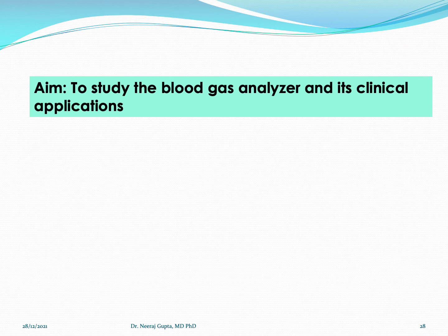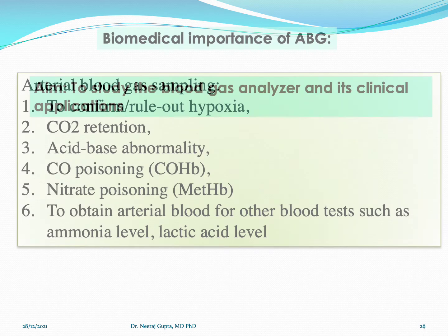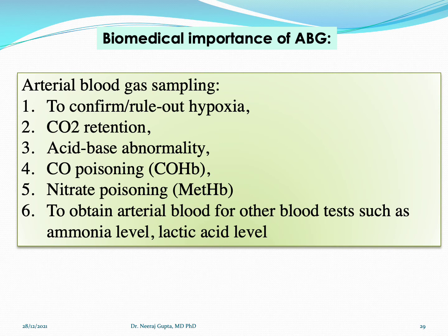Now let's move on to study the blood gas analyzer and its clinical applications. Let's look at the biomedical importance of arterial blood gas analyzer.